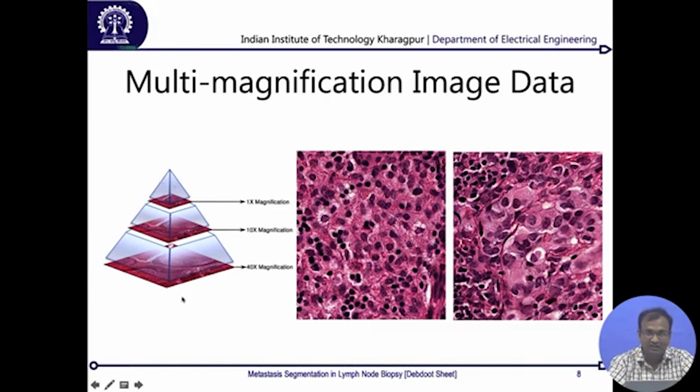of pyramidal decomposition format. Typically images are acquired at multiple magnifications, as we had seen in the lab scale demonstration, that you can have different objectives with different magnification. Here also, on the slide digitizer which we had shown on the earlier slides, you have similar kinds of objectives, and one objective with a different magnification is used at a time.